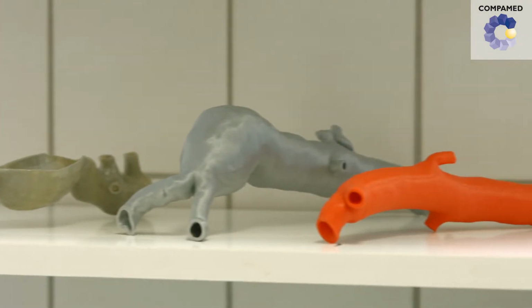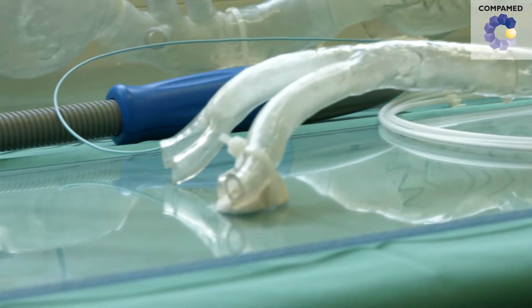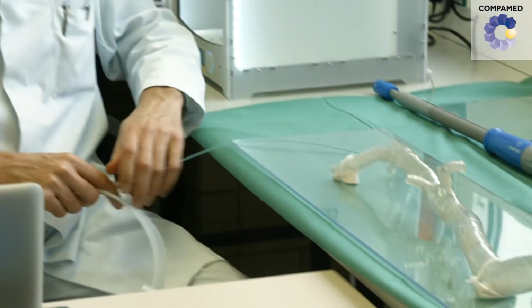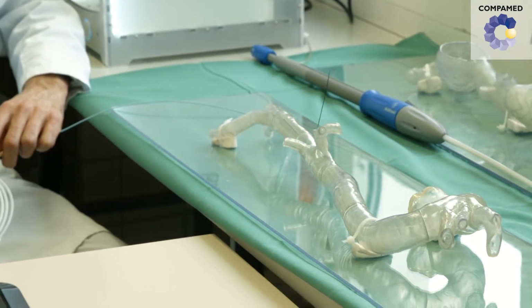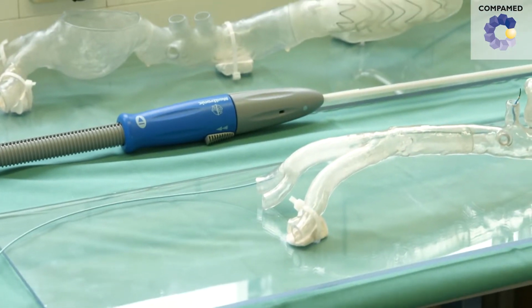One application is the creation of patient-specific 3D models, the other is the design of full-scale aorta models, enabling our students and technicians to practice specific procedures. These are techniques that facilitate the probing of individual arteries, individual branches of the aorta with guide wires and catheters, and testing the implantation of endovascular prosthetic grafts in this type of model.